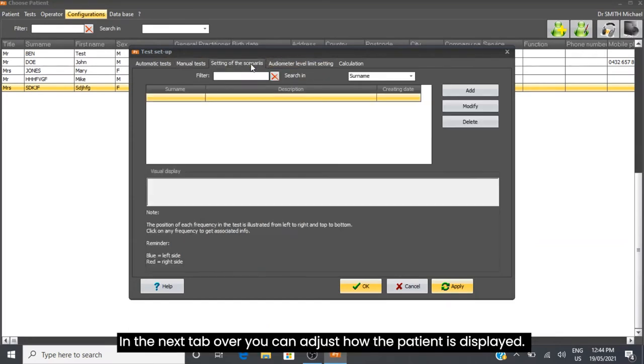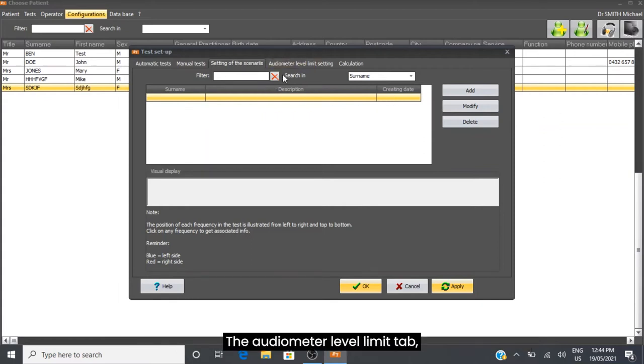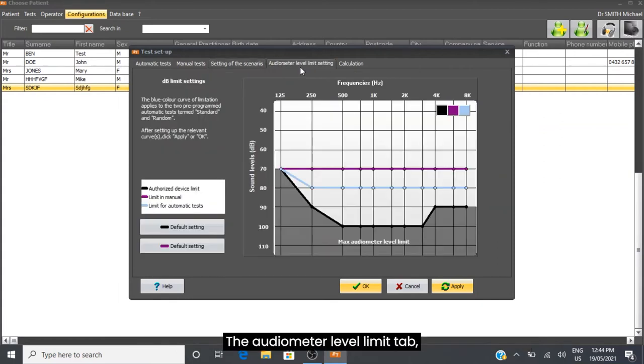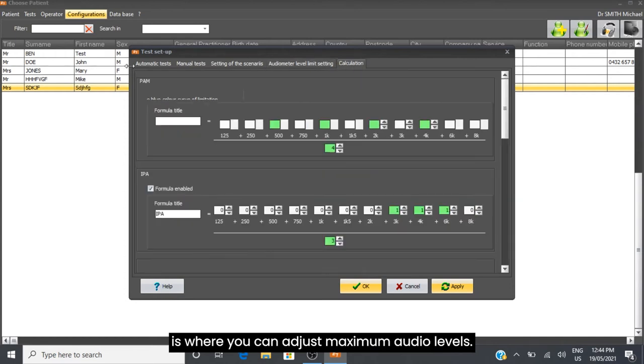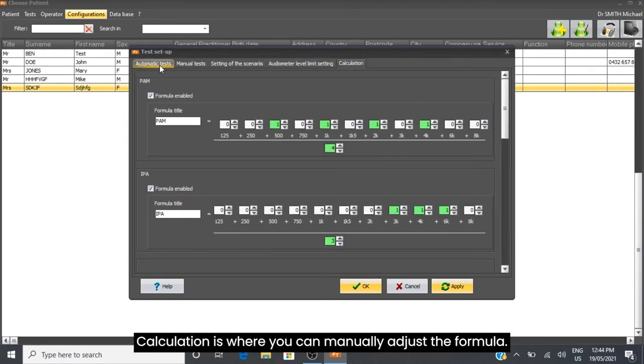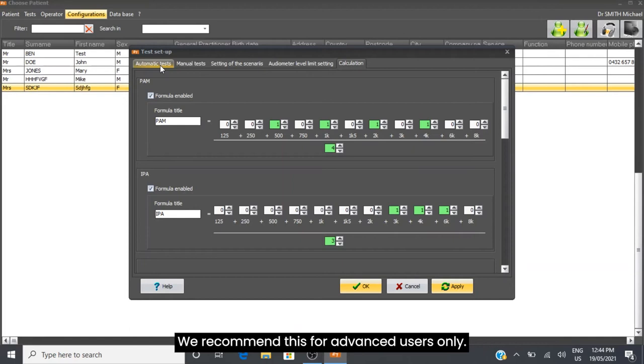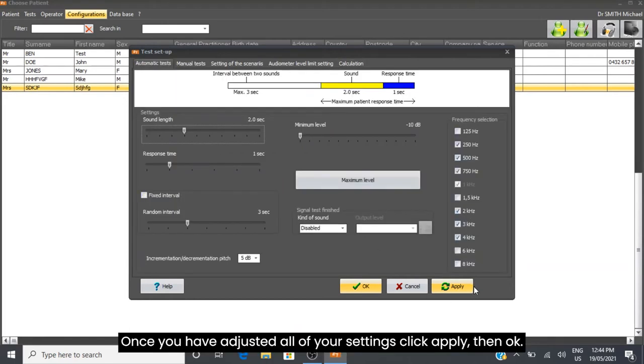In the next tab, you can adjust how the patient data is displayed. The Audiometer Level Limit tab is where you can adjust maximum audio levels. Calculation is where you can manually adjust the formula - we recommend this for advanced users only. Once you have adjusted all your settings, click Apply then OK.